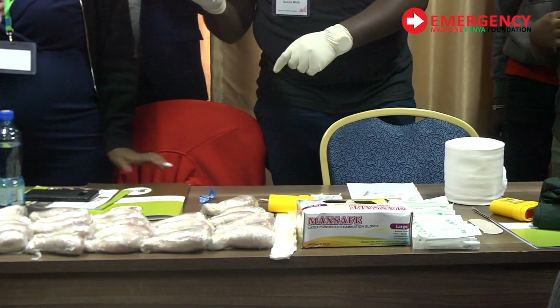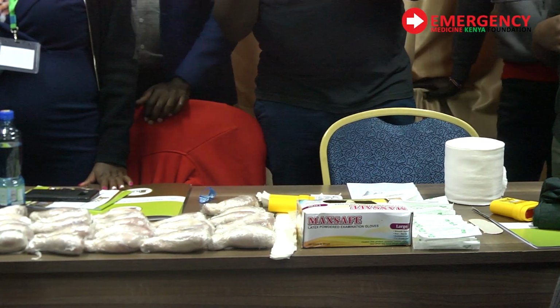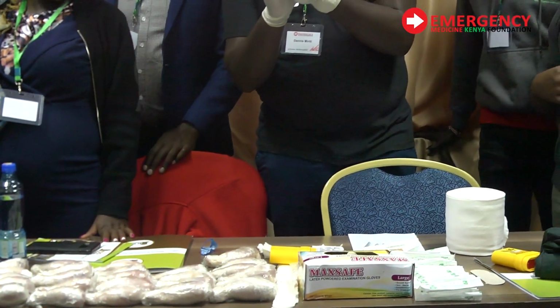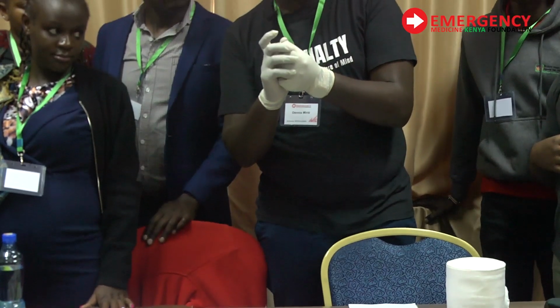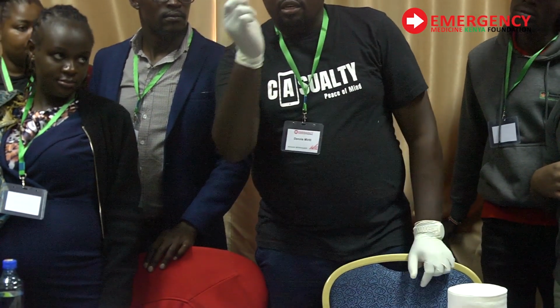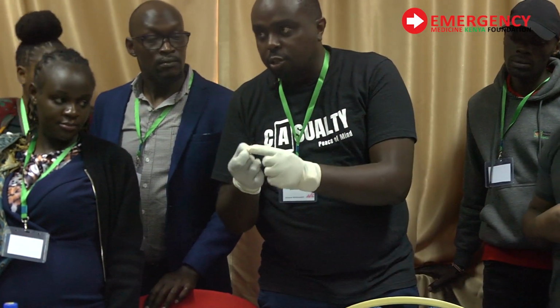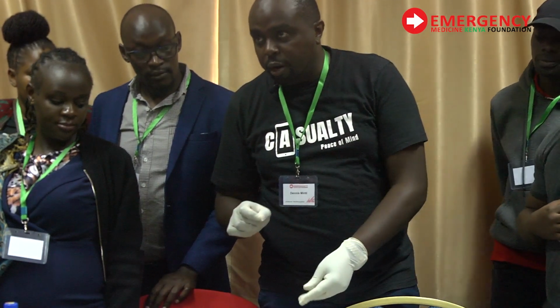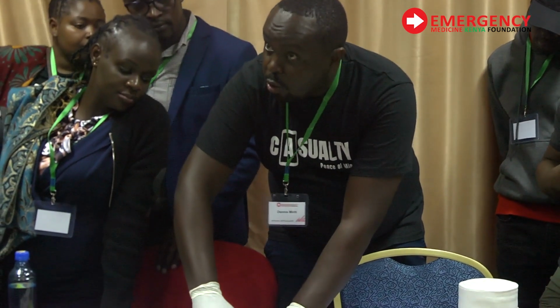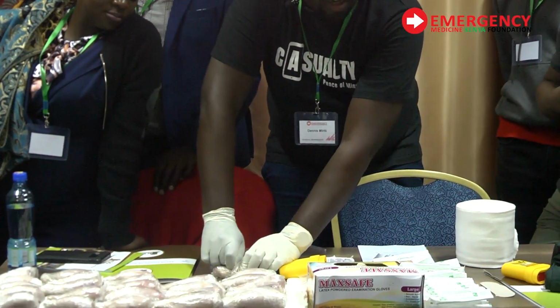okay, let's come back to the class. Once you have swabbed, whatever needle you are using, there is this part of the finger. It's very important for you to use that part to give it the force as you drill. Then your 2 fingers hold close to the needle tip, but you should leave a space that should be able to go into the bone marrow. Then, once you locate your site and you're sure you're on the bone, you just do a drilling. Just drilling like that. I'm already in.